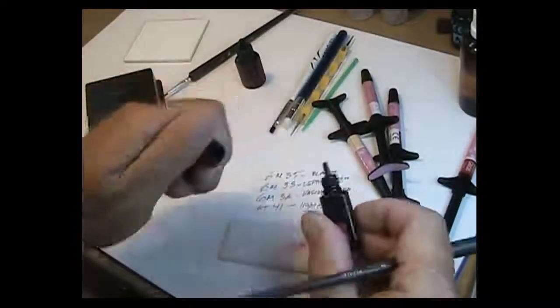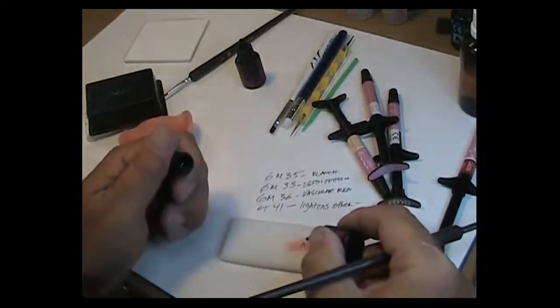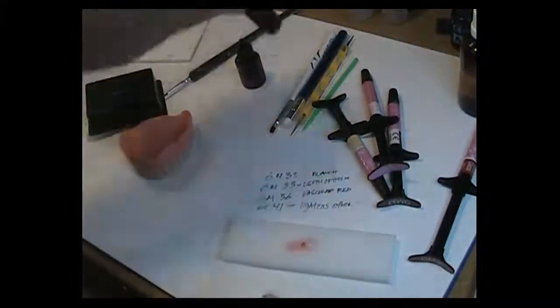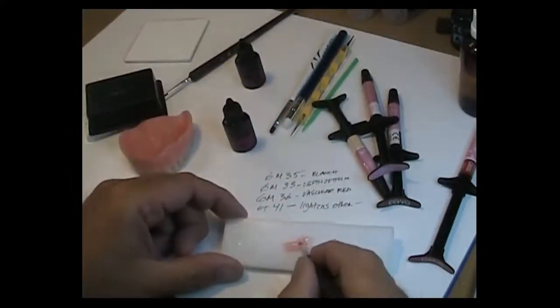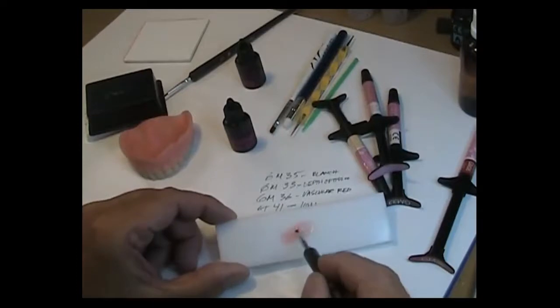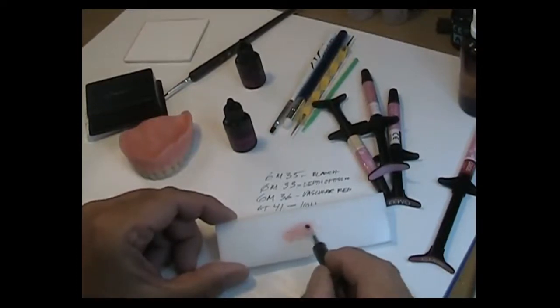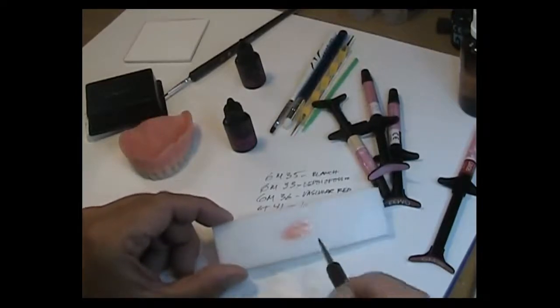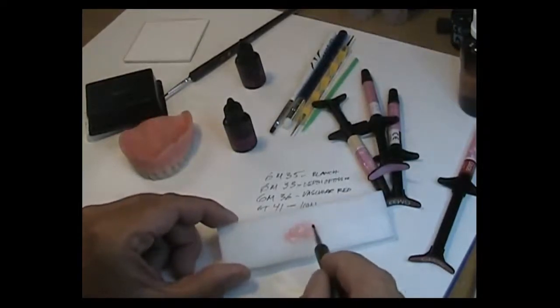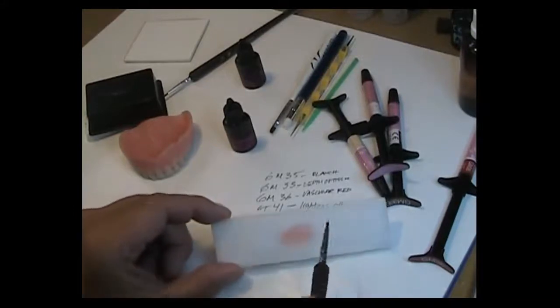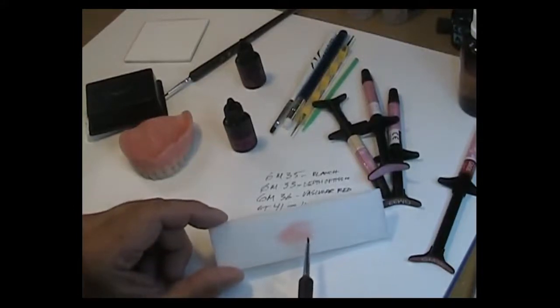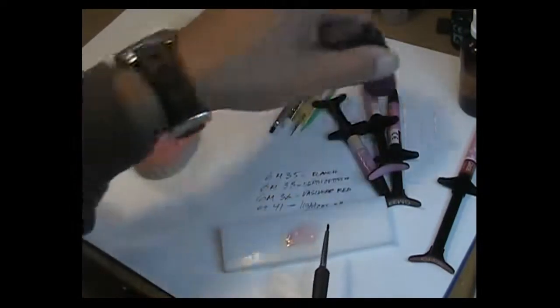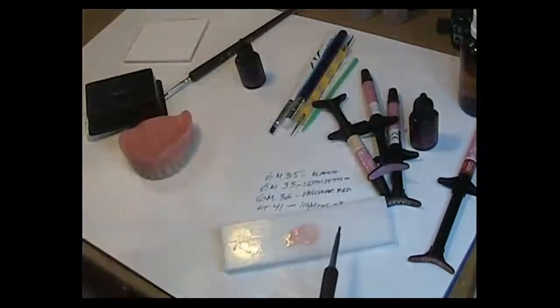What I'll do is we put down just a little drop like that. You might even want to keep a drop of that primer over to the side. But by using that primer you can see that it loosens up a precured material a little bit. That precuring again just comes from your light source that you're using to work under. But again, just a little helpful tip there and you can see that it loosens the intensity as well.